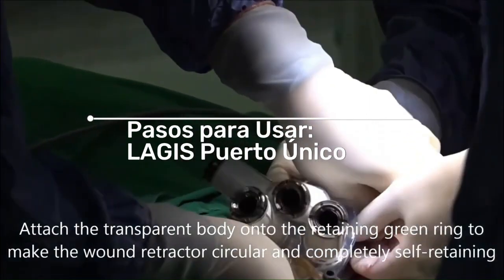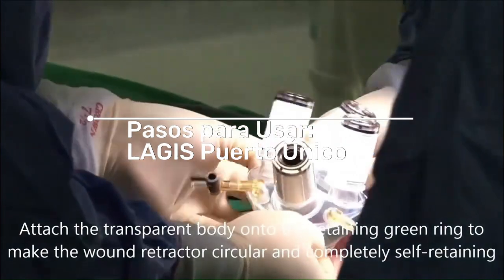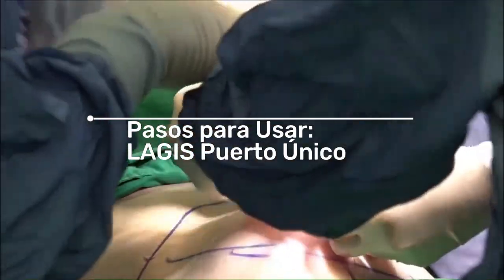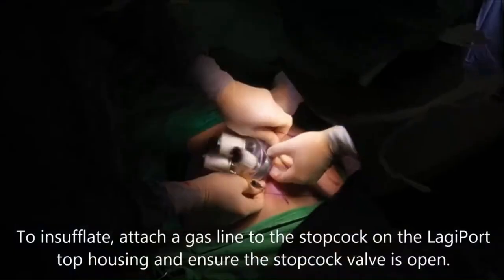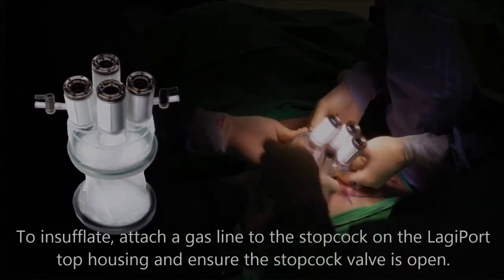LAGIS Single Port Access. Attach the transparent body onto the retaining green ring to make the wound retractor circular and completely self-retaining. To insufflate, attach a gas line to the stopcock on the LagiPort top housing and ensure the stopcock valve is open.